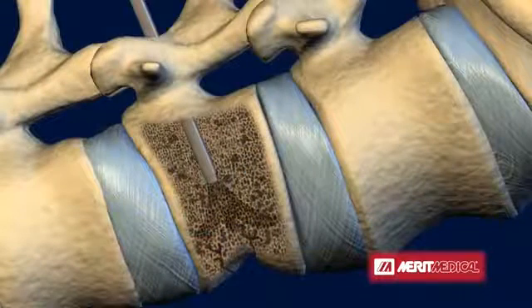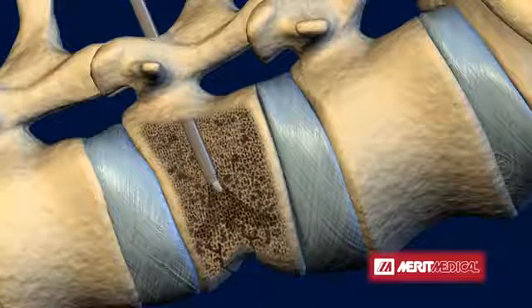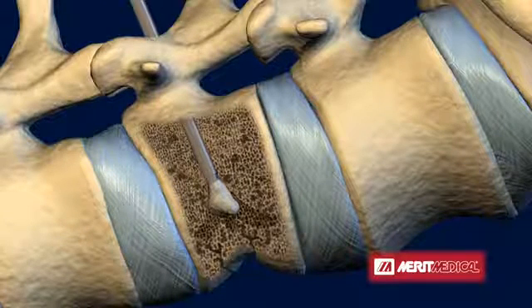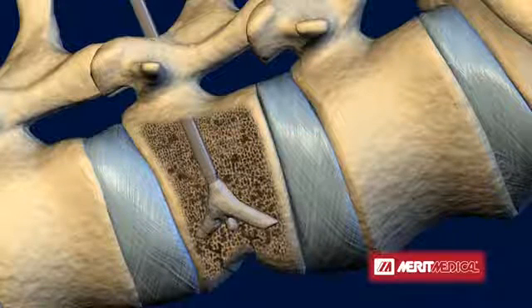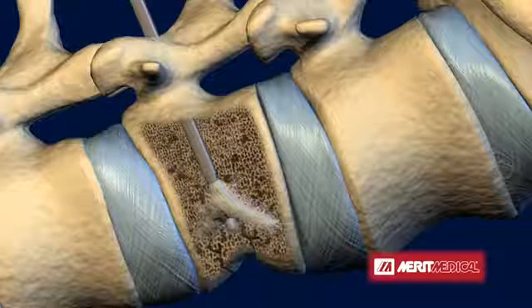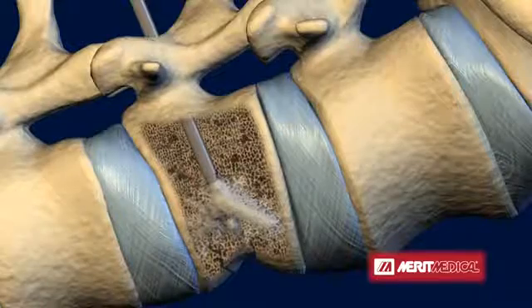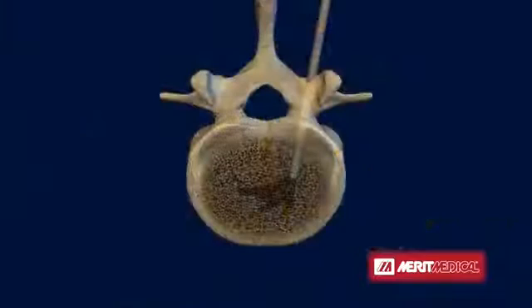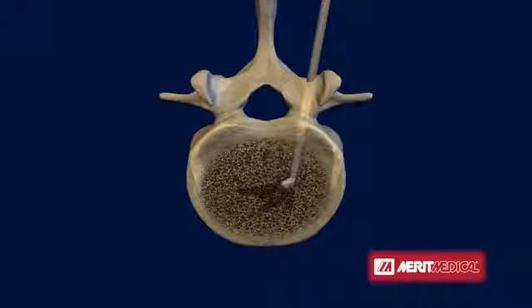Using a remote control hand switch, which permits cement delivery from up to 10 feet away from the radiation source, the physician delivers ultra-high viscosity bone cement into the vertebral body at a controlled rate. The cement preferentially fills the pathways created by the navigational midline osteotome and then interdigitates into the adjacent, intact cancellous bone. This targeted cement delivery optimally stabilizes the fracture and eliminates pain.